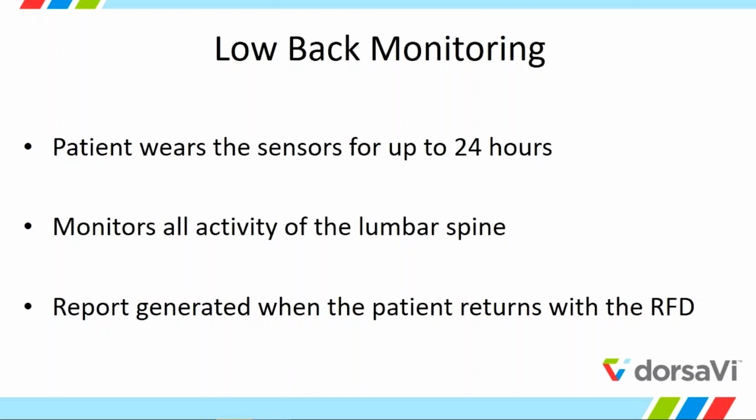So if you're not aware that you're slouching all day, or you're not aware that you're unloading your right leg all day and sitting in left side bending all day, and you wonder why you have left radiculopathy, you can't change it until you're aware of it. So this is a hugely important, useful tool for helping increase awareness, both for you and your client, to help them make a change, and obviously to direct your clinical interventions.